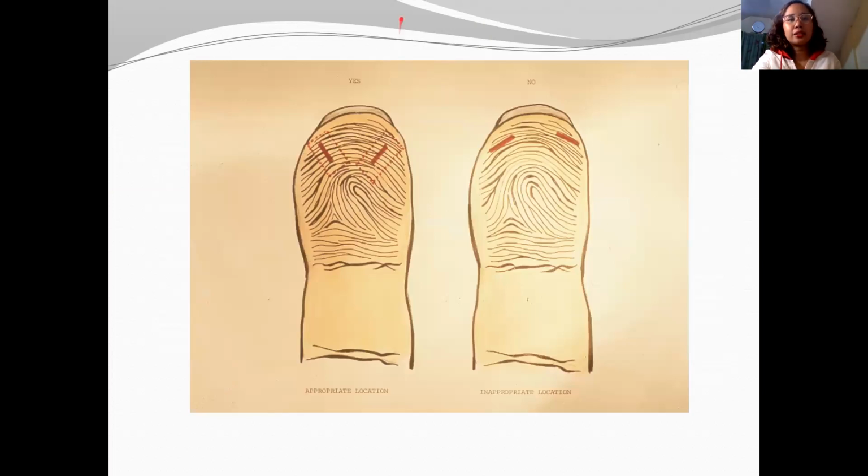So guys, this is the suggested prick, perpendicular to the fingerprints, so there will be a smoother flow of blood. Otherwise it gets messy if you follow the fingerprints of the child. However, sometimes the child is throwing tantrums and the main goal is just to get the puncture, which is okay, no problem. But if the patient is calm, make sure that your puncture is perpendicular.